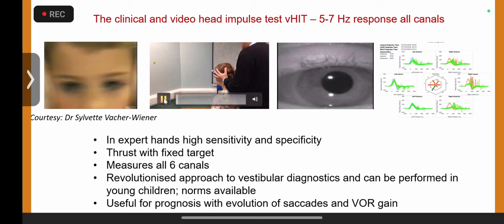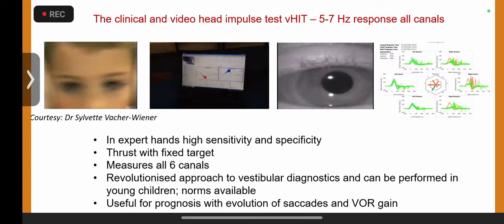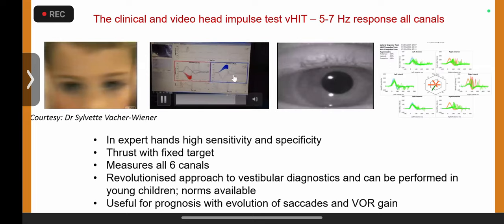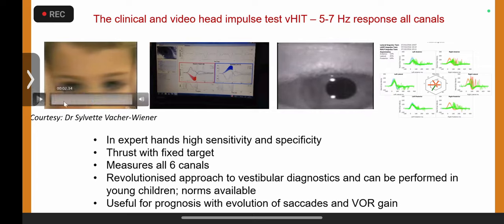This demonstrates the fixed target approach from early days. Note: you should never touch the band during the test. When using the video head impulse test, you measure the compensatory saccade — I'm thrusting or moving the head. There we go: nothing on one side, clear catch-up saccade on the other, clear catch-up saccade.